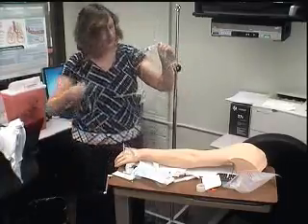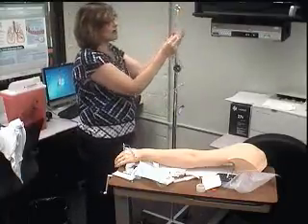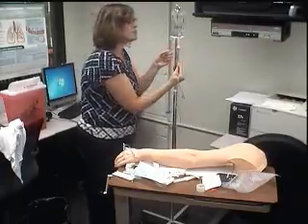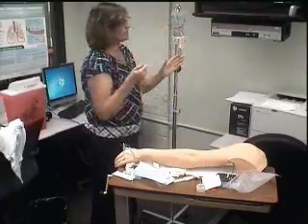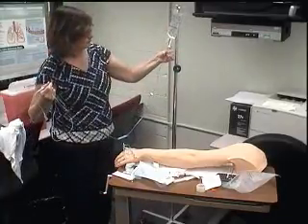Okay? So, I'm going to hang it. By the way, you could have also hung it on the pole, pulled the thing, and pushed it in this way. Because even if you take the little cap off, until you spike it through, it's not open. So I could have hung it and then poked up this way. So now I got it here. I want to fill the chamber about halfway full.